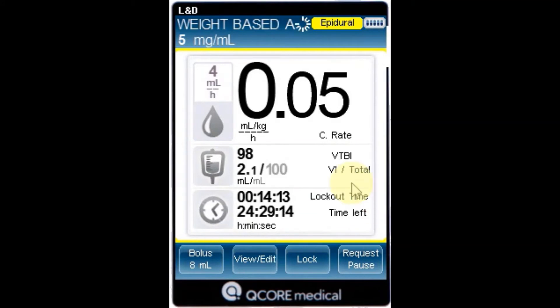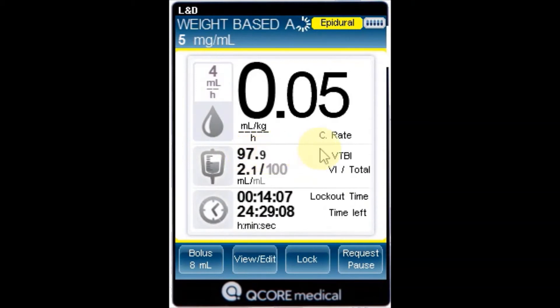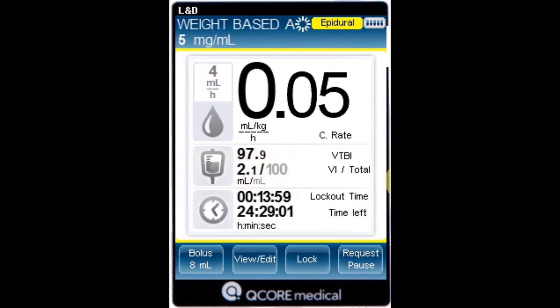VTBI: the total volume left to be infused. As the infusion progresses, this value decreases. VI over total: the total volume that has been infused during the current infusion, including KVO if applied during a delayed start period, over the total VTBI value programmed. As the infusion progresses, the VI increases and the total remains constant.